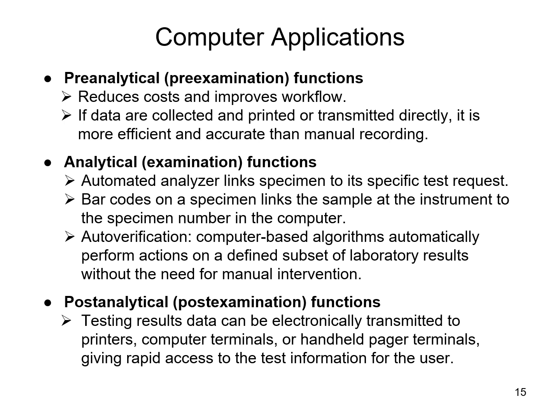Your analytical phase is when you actually examine the sample. So being able to have any sort of computer application involved in that allows for barcode tracking again so that the analyzer can read it. You can also set up programs within your computer system where if the results fall within this category, if they're within these values or within this range, then you can go ahead and send these results out to the electronic health record.